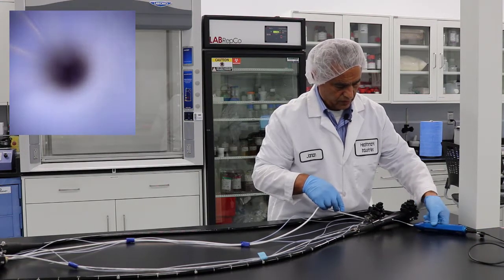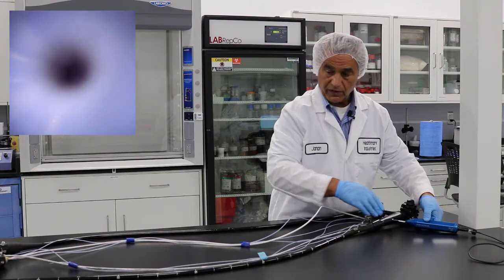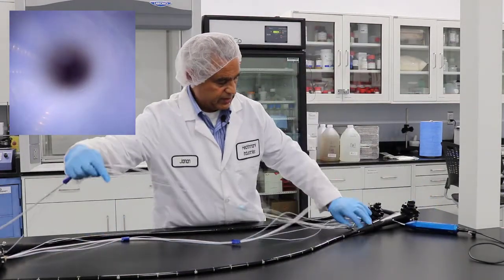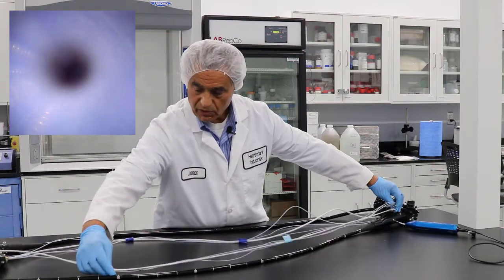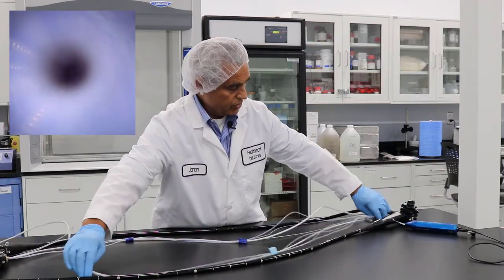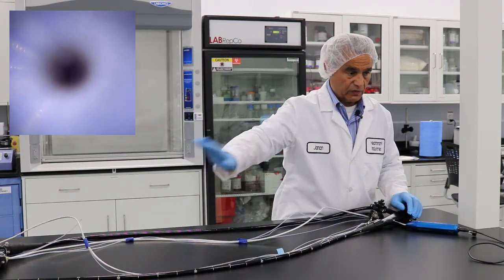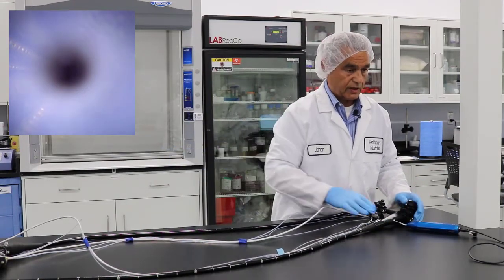Right now we are at this level — if you compare it to the skeleton of the scope, you're about here and you have that much more to go. We do this from one end, and then once we finish we go to the distal end.